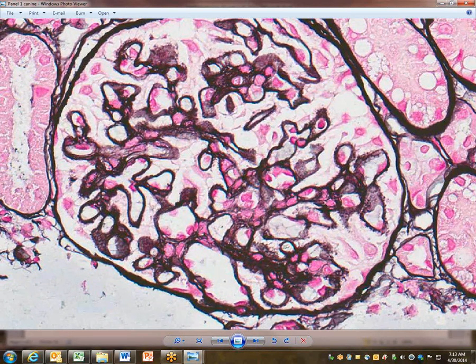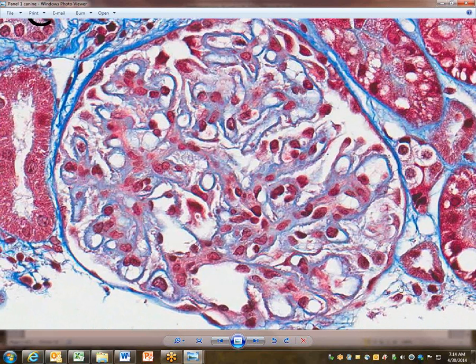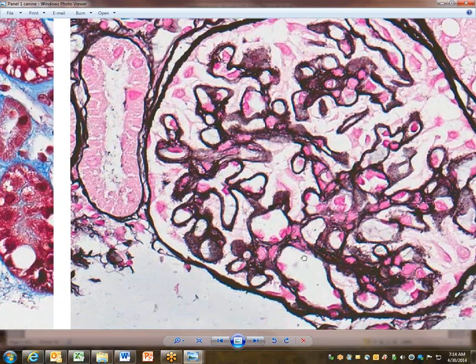Well, I would suggest to you that this one, and especially out here for being so peripheral, they're a bit too thick. Okay, they're thick. Yeah, I'm with you. And this is the trichrome. Let's go back to the Jones here just for a minute.